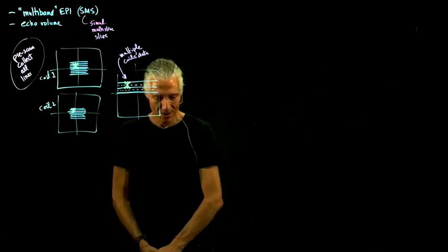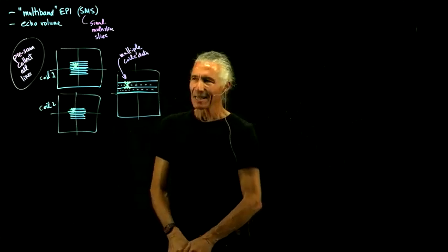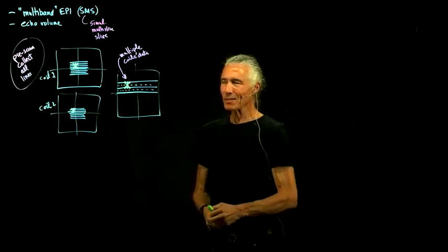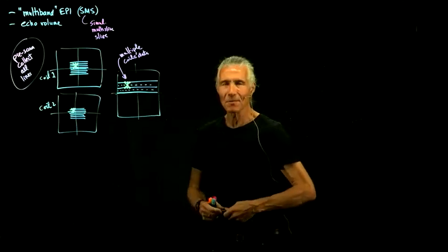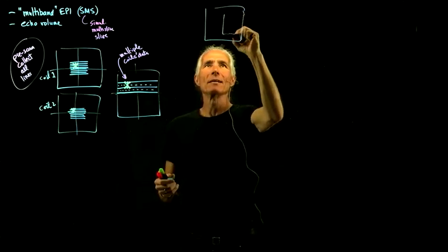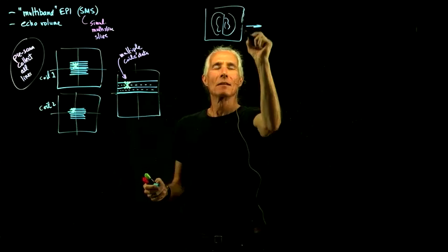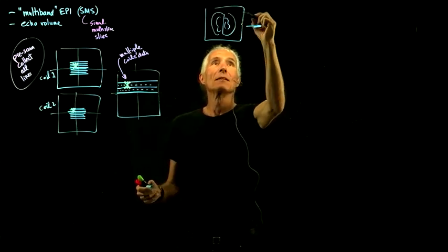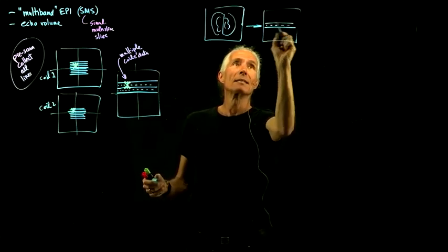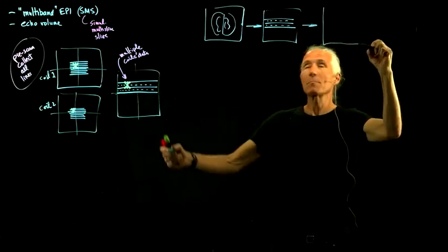So how is this related to multiband? Well, it's almost like we left out some of the data, even though we didn't. So let's just look at what happens normally. So what happens normally is we've got a brain, and when we do our data collection and leave out half the lines, and then do an inverse Fourier transform, we end up with what I just showed you there.